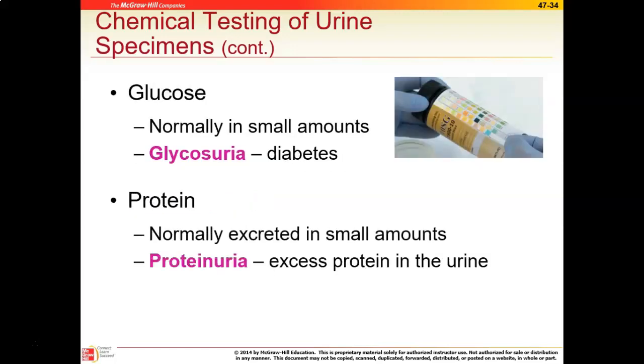Next two are glucose and protein. Now there is a special small dipstick that's used in obstetrics that has just these two pads on it for glucose and protein. They're also present on the longer 10 reagent strip dipstick. But when we look at glucose, obviously small amounts, especially after drinking a soda or eating a candy bar, can be normal, but having larger ranges or higher amounts of sugar can indicate that someone is diabetic. And so that's why glucose is one of the dip pads on the short dipstick for pregnant patients, because it can sometimes let us know whether or not that patient has gestational diabetes.